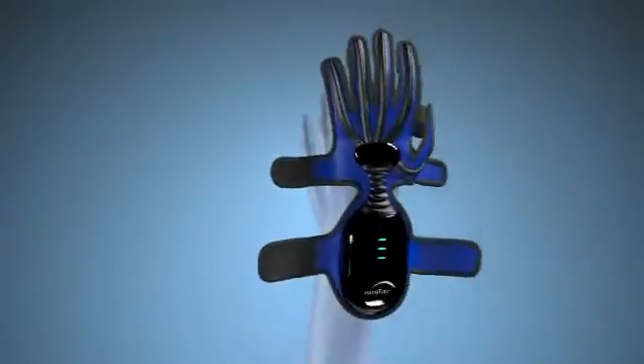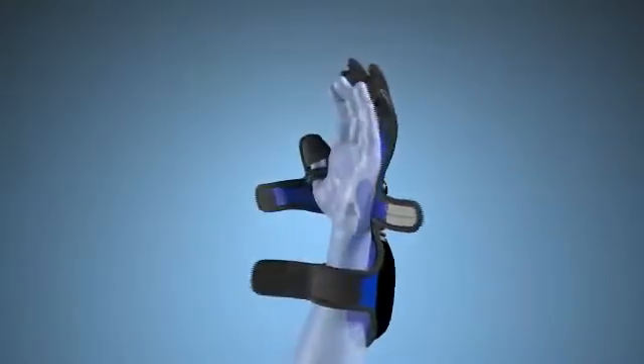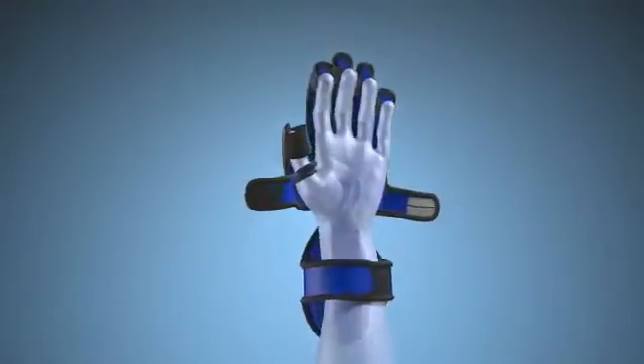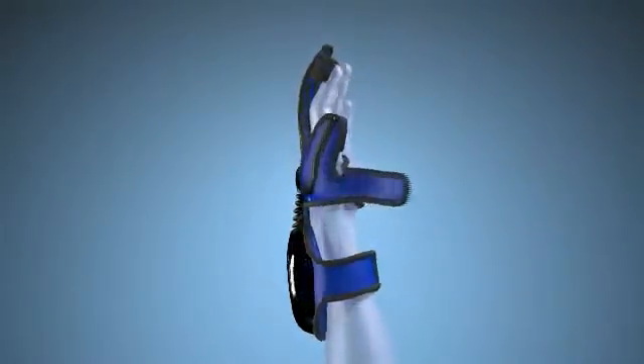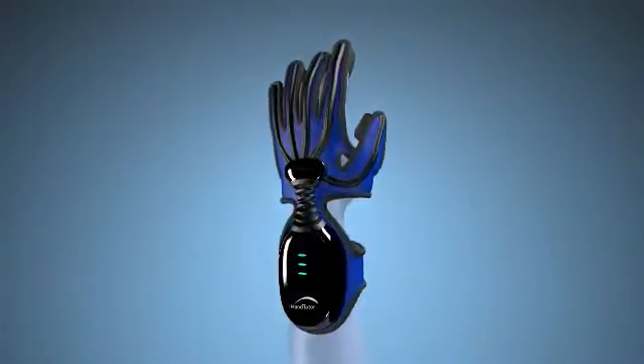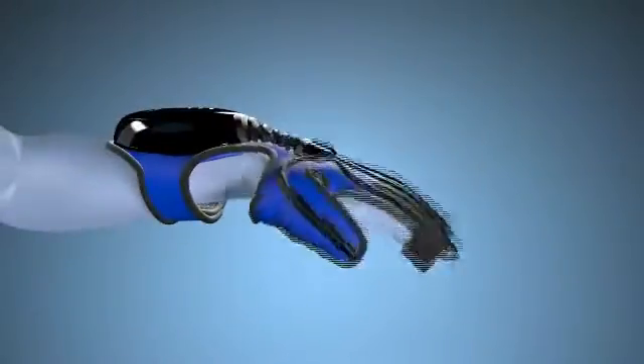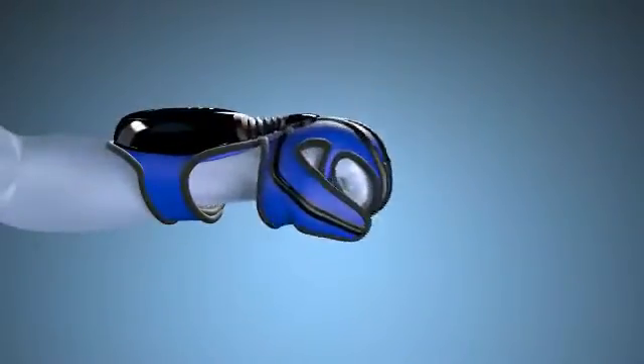The Hand Tutor system consists of an ergonomic glove that is easy to put on, even if the patient has severe hand movement limitations and limited range of motion. The glove is comfortable and easy to use during hand exercise treatments and movement evaluations. The Hand Tutor allows for full movement of the wrist and fingers and does not limit the patient's range of motion.